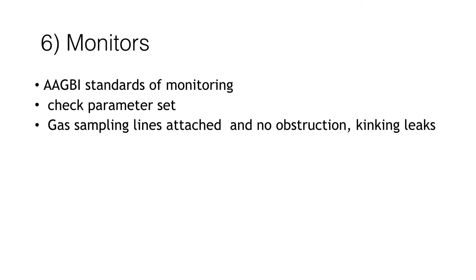You should check that all the monitors are configured correctly within the limits of what you would like, and that there are no obstructions, kinking, or leaks to any gas sampling lines.